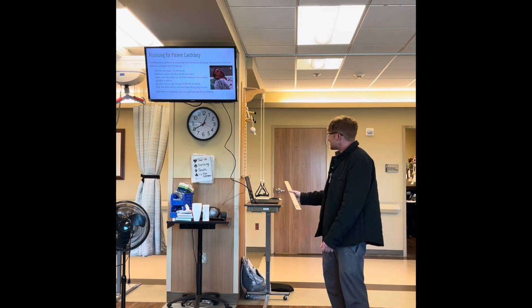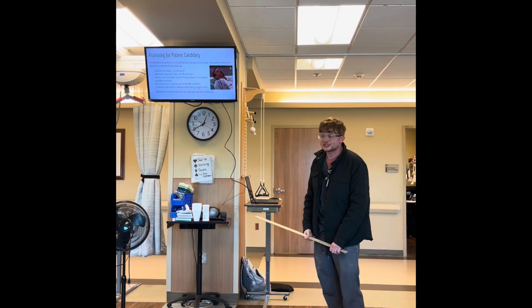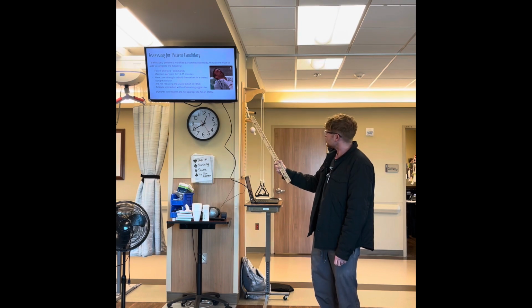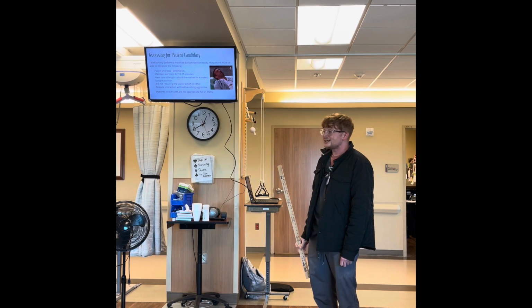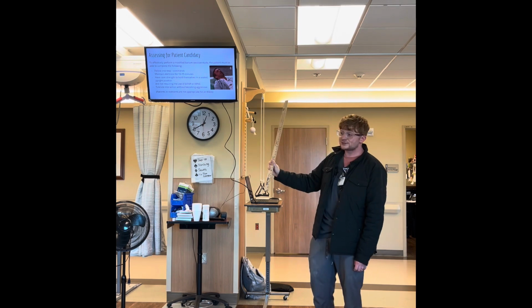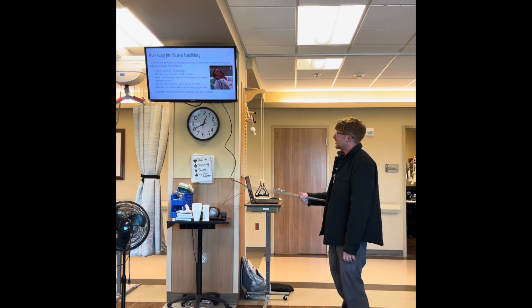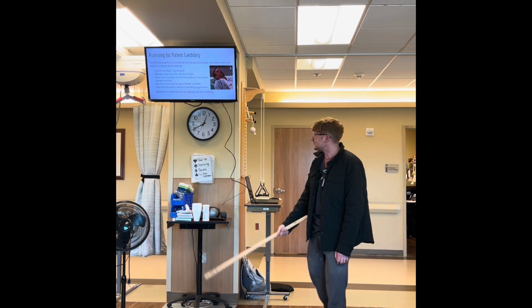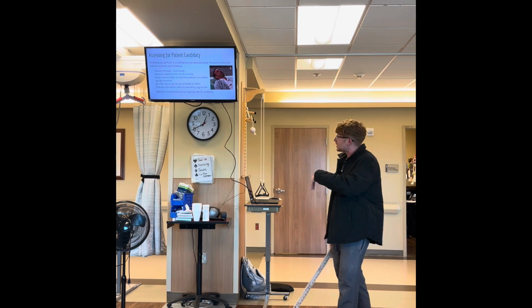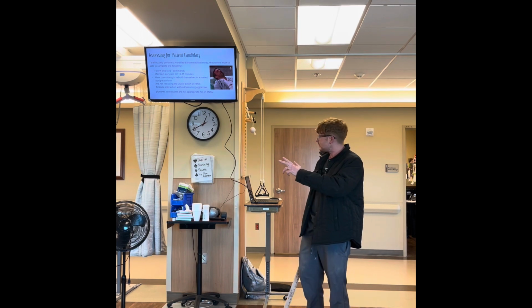The next thing we're going to have to do is assess for patient candidacy. If we go in and that is how they look all the time, probably not a good idea to take them down for a modified because they are not going to be able to wake up. Their head is back, mouth open posture. They're not going to be able to follow the one-step commands that we need them to do. So when we're looking for a modified, we want them to be able to follow just one-step commands for the most part.